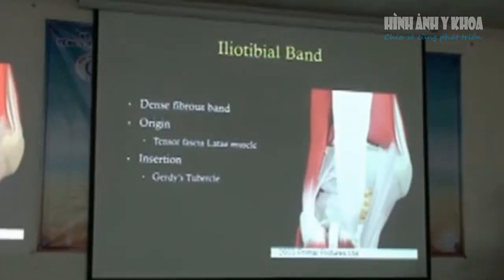So we have a look at the iliotibial band, and that's a dense fibrous band which actually starts up quite high on the hip and then inserts all the way down onto Gerdy's tubercle. Như trong dải chậu chày á, đây là một cái dải sợi dày bám từ vùng cao của háng và đến bám vào cái củ Gerdy của cái xương chày.